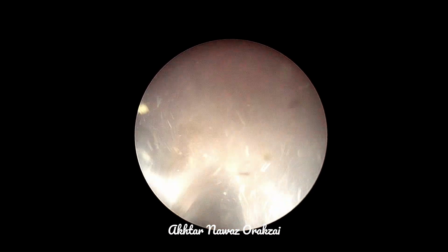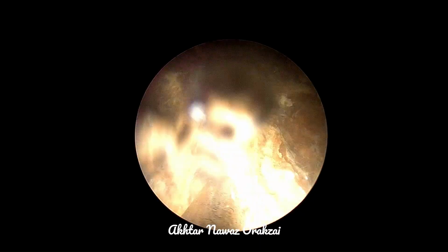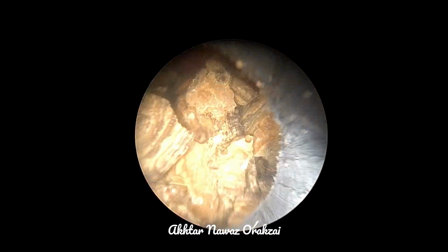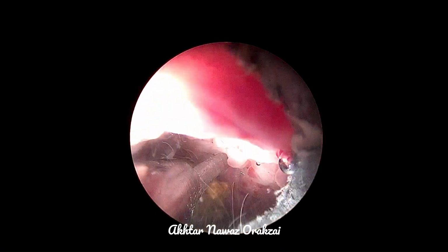Having the enlarged prostate, it was very clear that the stone could not be dealt with per urethra. So something different had to be done. One way of doing this is by doing a vesical lithotomy, and at the same time doing a transvesical prostatectomy. But as transvesical prostatectomy has its own morbidities, the patient was reluctant to undergo an invasive procedure for his prostate.